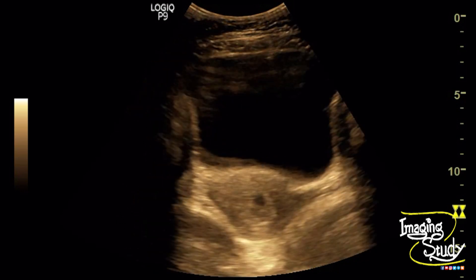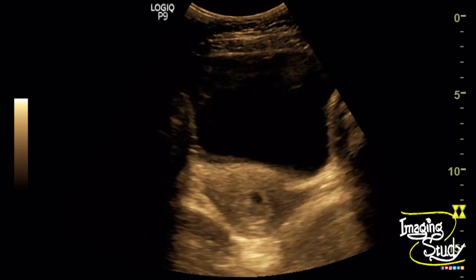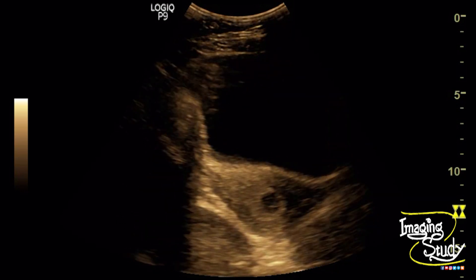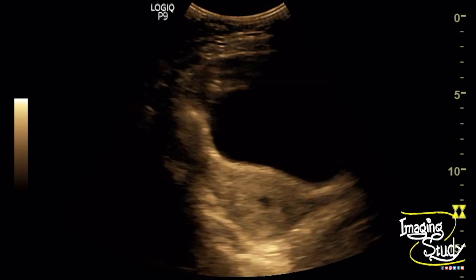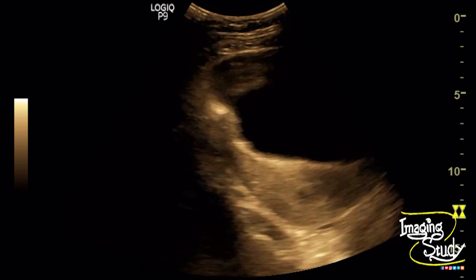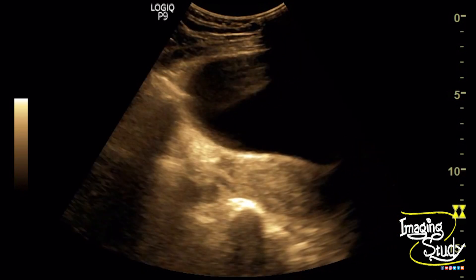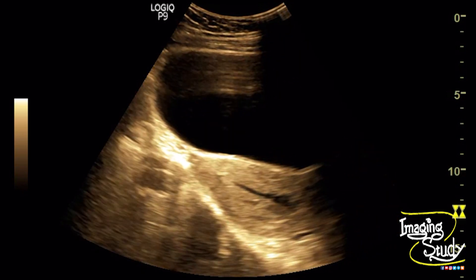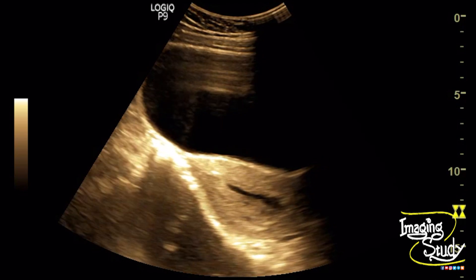From this image it's not possible to measure the gestational sac diameter or mean sac diameter, which goes in favor of incomplete abortion, as the patient was complaining about pervaginal bleeding.